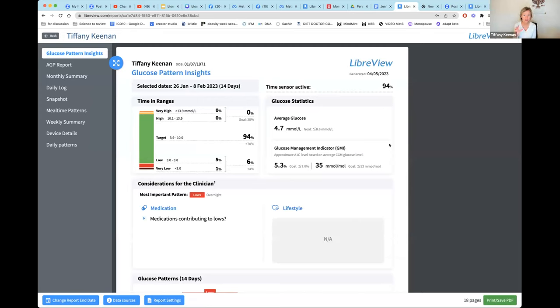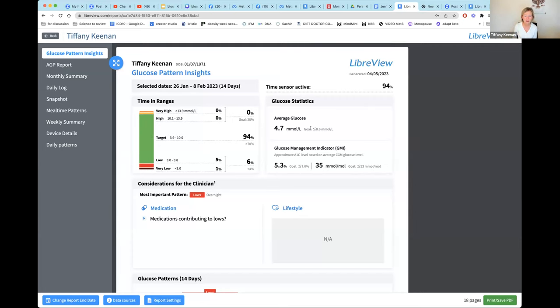Once you click the big blue 'Glucose Reports' button, it provides a breakdown of everything in that two-week period. The first thing it shows is time in range. For non-diabetics this isn't as critical — what we're really looking for is your day-to-day data. For diabetics, time in target is very important per guidelines. It also shows your average glucose — mine was 4.7 over 14 days, with a goal of less than 8.6.